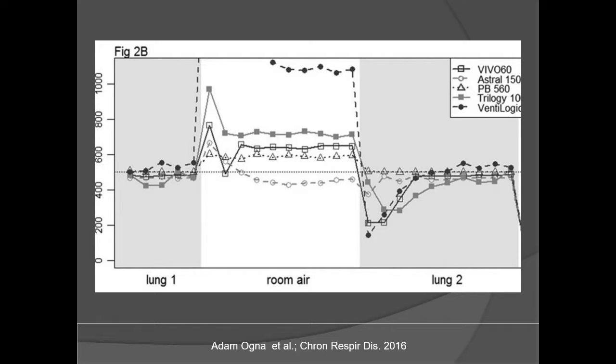At the moment they are pursing the lips, you see that according to 5 different devices, the devices took from 2 until 5 cycles before giving the right volume. Why do I say that for you during this webinar? Because indeed you have to set higher tidal volume because patients constantly are busy to connect and disconnect, meaning that they are constantly using the mouthpiece in these circumstances.